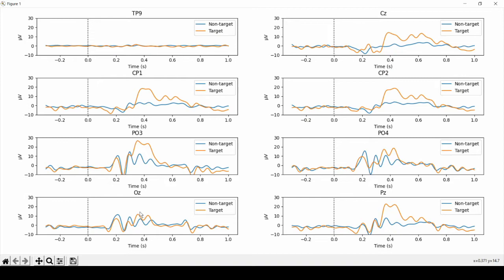Moving on to OZ, that is around the visual area of the brain, we already start to see a small effect, where the orange graph starts to be a little bit more positive than the blue one.